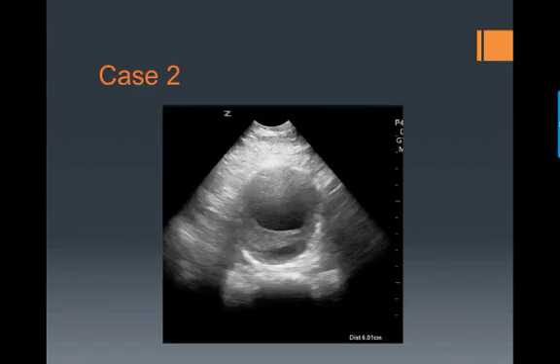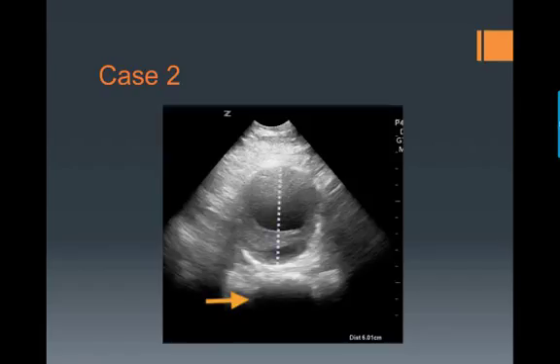Here's what you see when you do your ultrasound. First you locate the vertebral body, then you identify the aorta, you measure from outer wall to outer wall, and you get a measurement of 6 centimeters. You can also see a large thrombus.